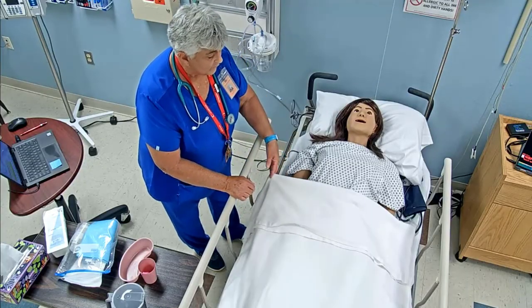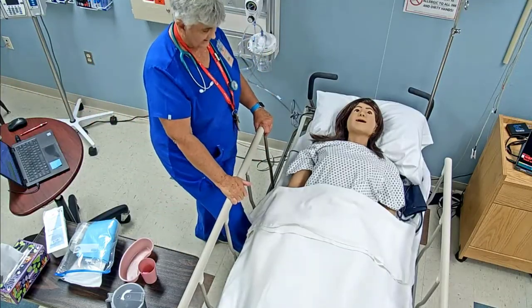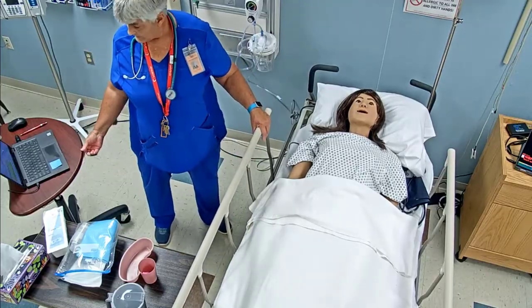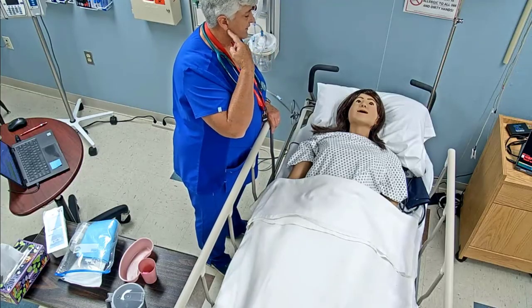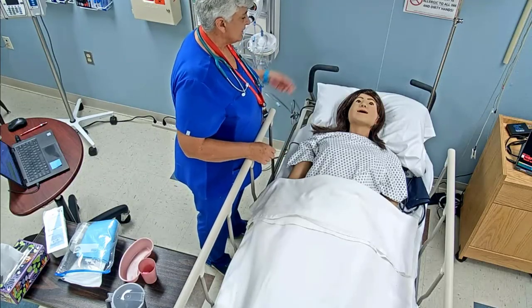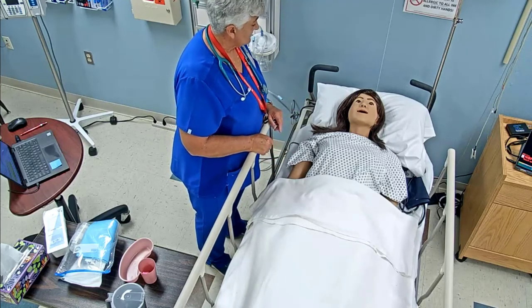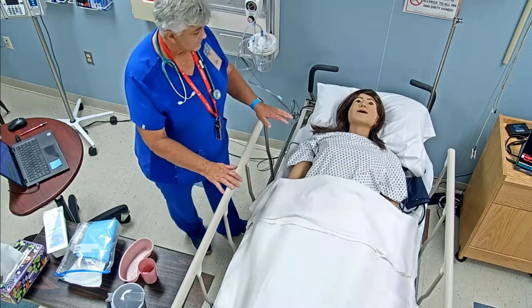Okay, so one of the things I'm going to make sure I've provided for is privacy, asking anybody to come out. I'm going to raise the bed to a good working height. And now, as I was saying, we're going to be putting an NG tube down. The doctor wants a tube that's going to go in one of your nostrils, go in the back of your throat, and go down into your stomach. In this case, it could be that we're going to connect it to suction, maybe to feeding, which according to the order we're going to do later, or just in case you need it, and we're going to give medications too. Sometimes they do that as well, okay? So do you have any questions for me?